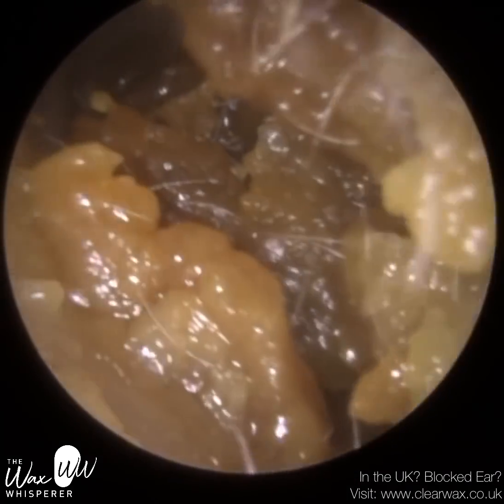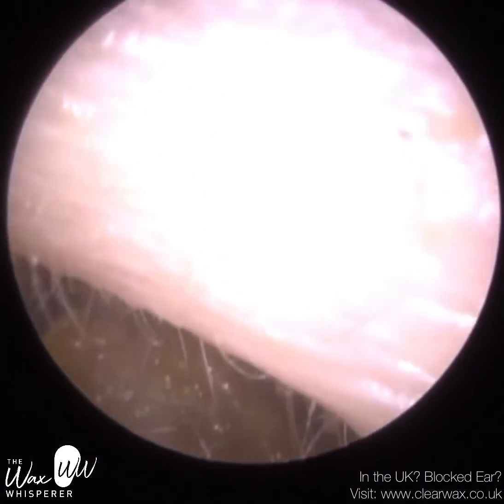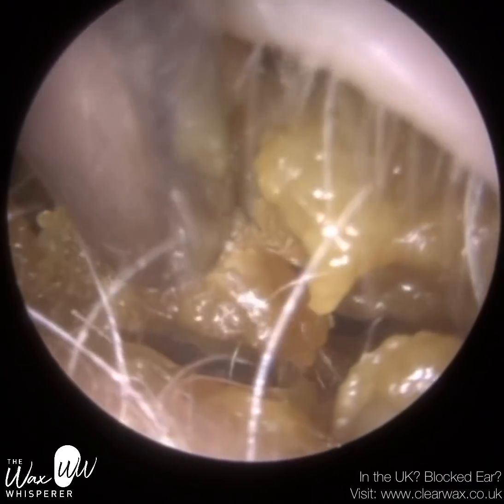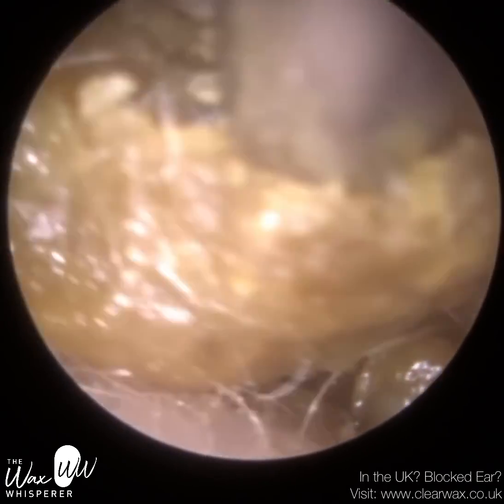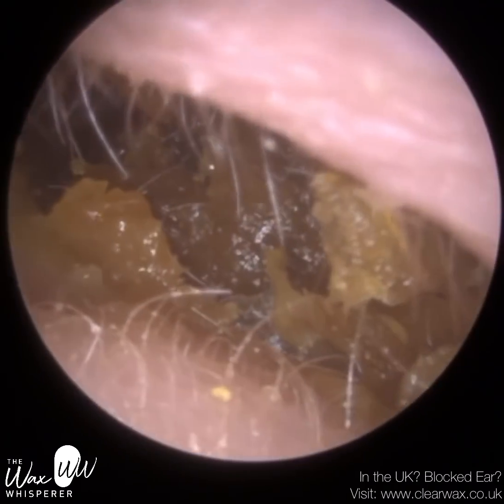This is a video of a patient who attended with a condition called surfer's ear, otherwise known as exostosis. And you'll see after I remove this dry skin and wax from the ear canal, medially, so towards the eardrum, on the bony part of the ear canal, the patient has some quite prominent and pronounced bony spurs.